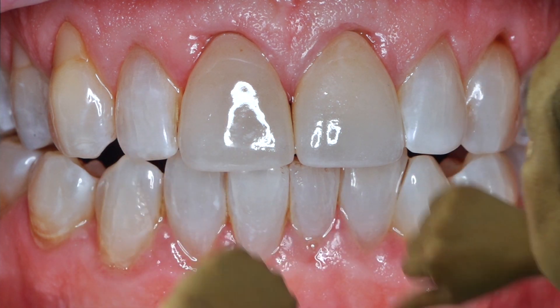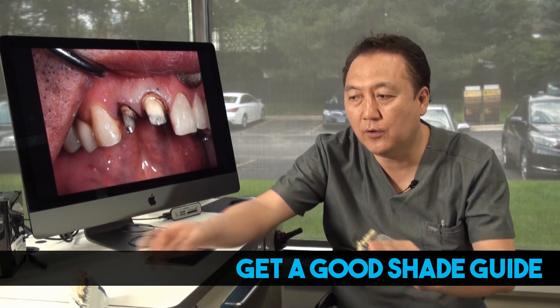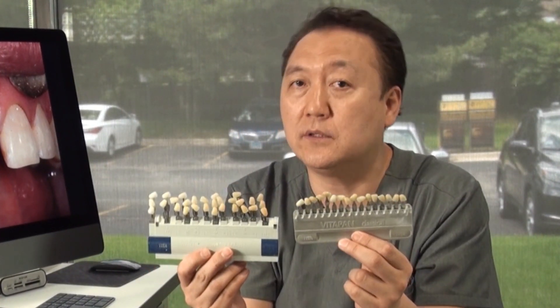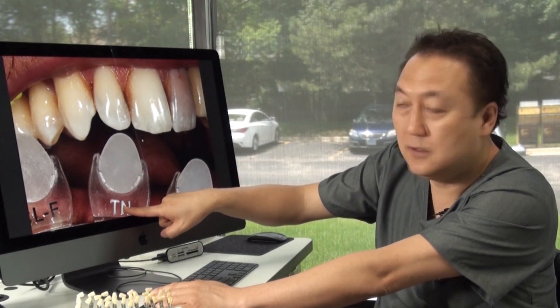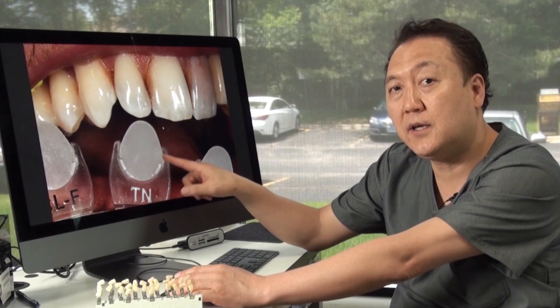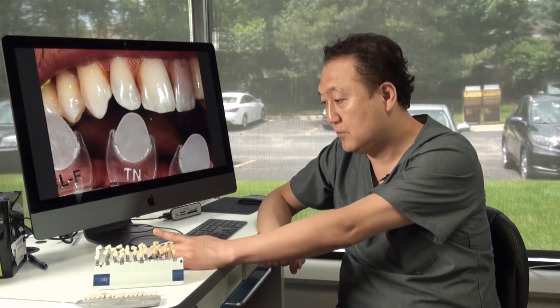So what they can do: after trying on the crowns, close the lips and have them get the saliva back. Wait about 30 seconds to one minute to get moisture. You need a proper shade guide. This is the Vita shade, this is the classic, and this is the 3D. Unfortunately, it's not matching natural teeth — I'm telling you, only 5% matching. It only matches whoever has a fake restoration in the patient's mouth. I can also utilize our own shade tab, which is the porcelain system — GC Initial porcelain system. They have their own shade tab, about one millimeter thin. The colors are indicated, and I can prescribe it to make better color matching.